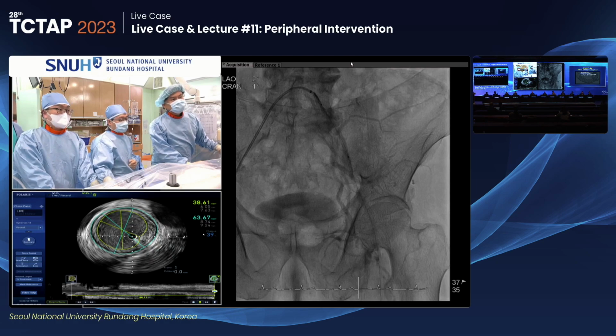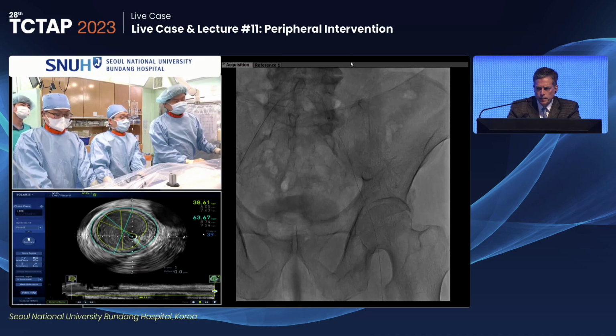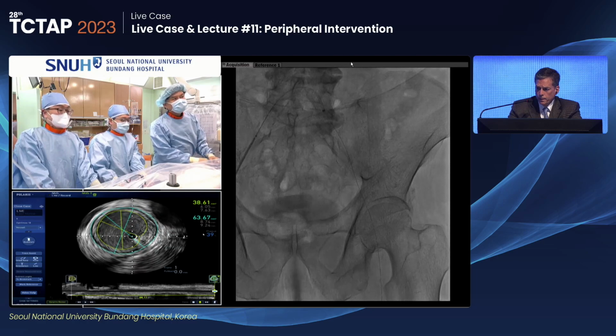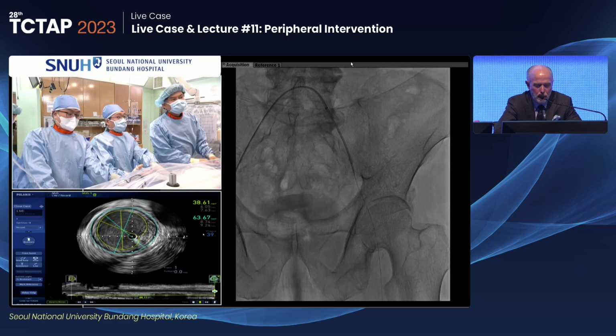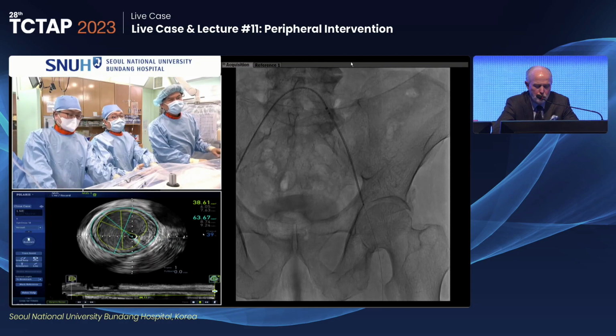Okay. I like the idea of a self-expanding stent rather than a balloon expandable stent here, though. That's sure, yeah, the best answer. I would prefer having an 035 wire as well down there. Worry about getting caught. Well delivered. Yeah. Recently, we have a just pending publication.